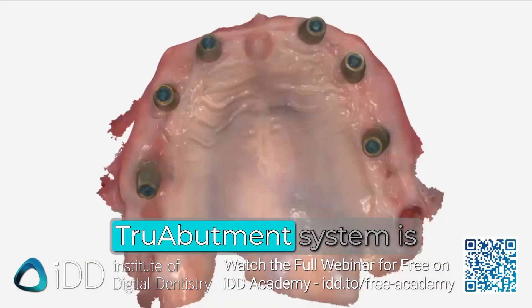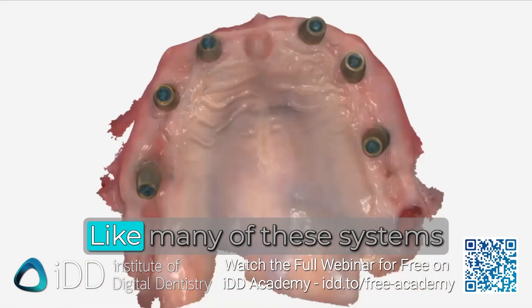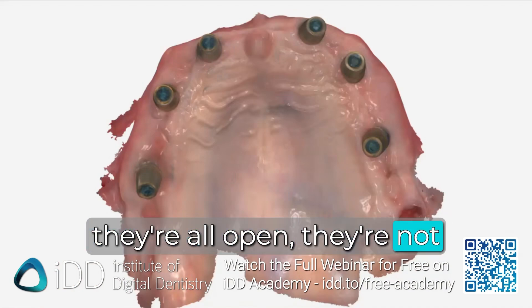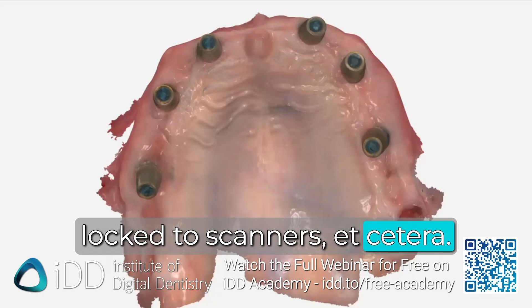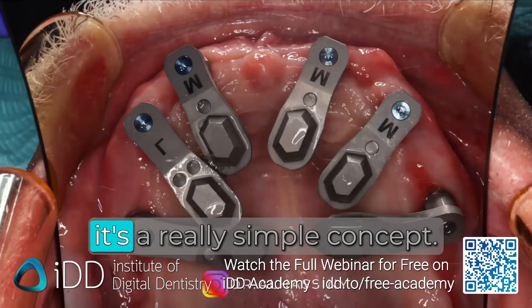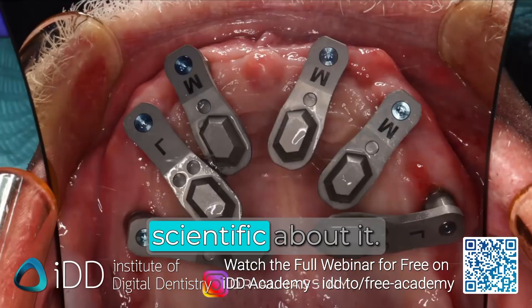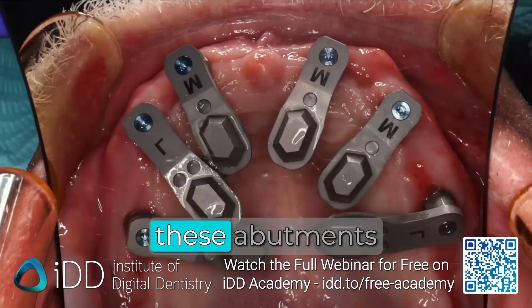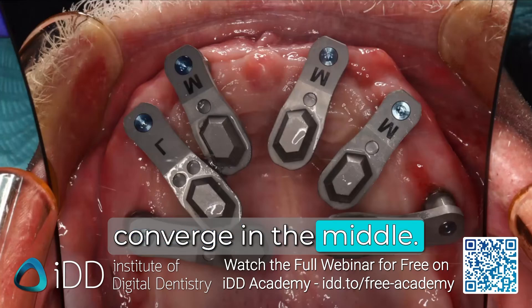The beauty of the True Abutment system is that it's an open system — like many systems on the market now, they're all open, not locked to scanners. And the whole idea of this is a really simple concept. There's nothing super scientific about it. You don't need to stress out. You just have to make these abutments converge in the middle.